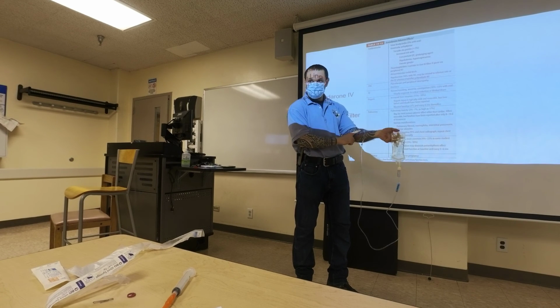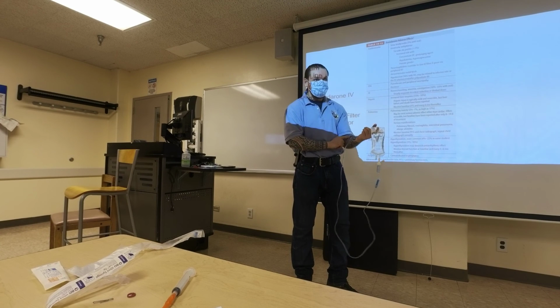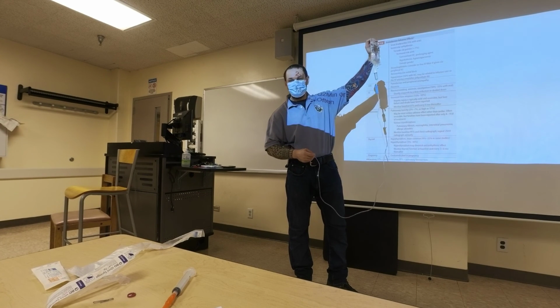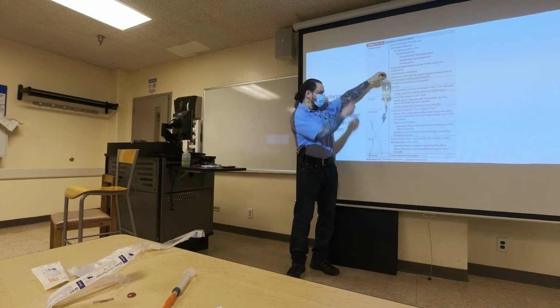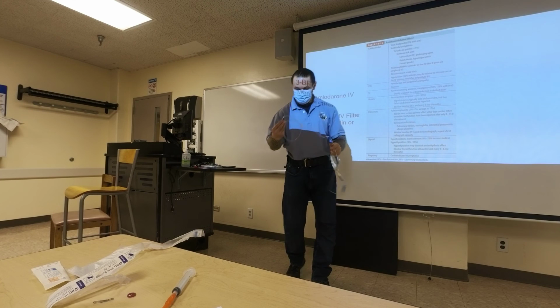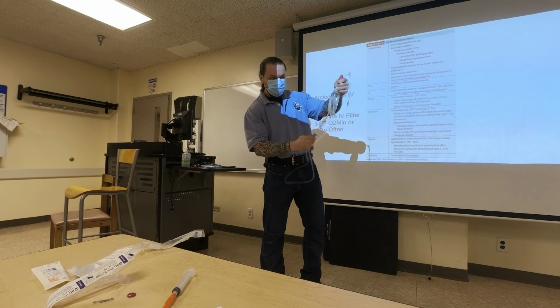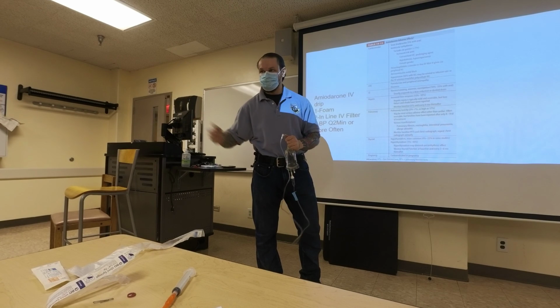So what's the problem with this? Are you able to continue fluids or switch medication? Exactly. So that's why, before you start to infuse it, you set up your regular bag, let's say a 1,000 ml or 500 ml bag of saline. You set up your saline going in, and then this medicine gets connected almost like a piggyback to this port. Why is this important? Because the moment I close this off, I already have my saline ready to go. I open this up and infuse, so I can bring up the blood pressure.